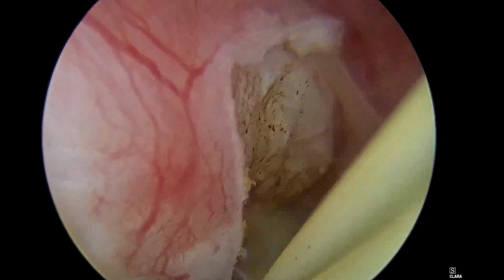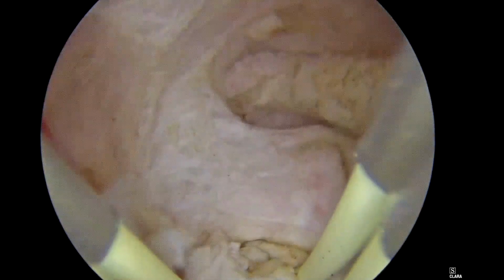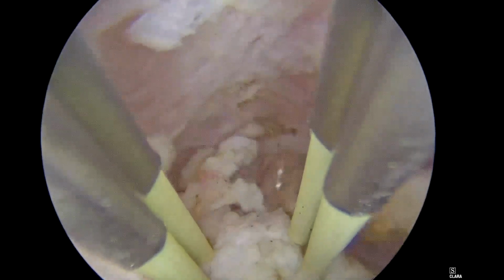Here is the most important clip showing the bubbles getting swept up. Look at this shower of bubbles. This occurs when activating the bipolar current, a phenomenon which deserves attention from experts, from industry and manufacturers. How far is the safety of using bipolar?